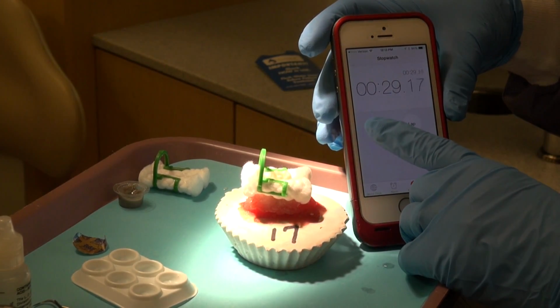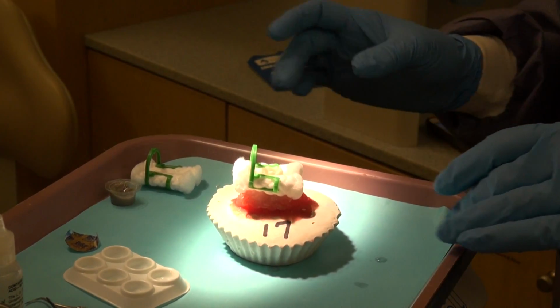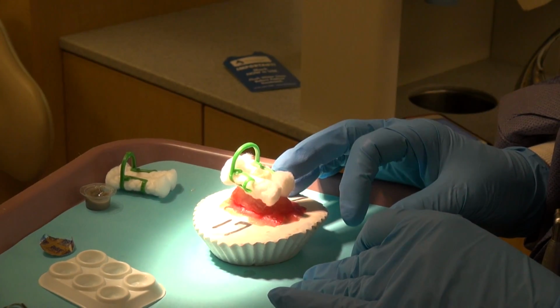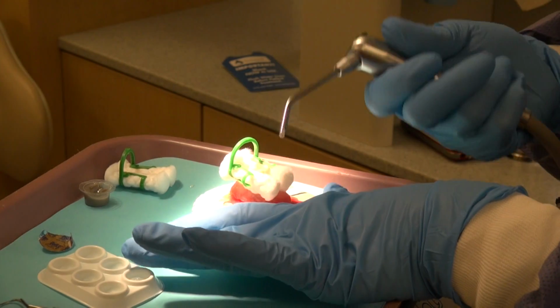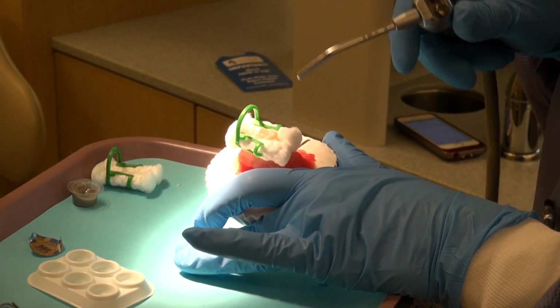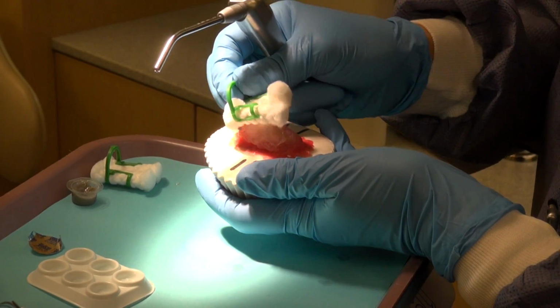And we'll rinse off the acid etch. Now, when you have this in the patient's mouth and you go to rinse off, you want to hold your HVE tip close to the acid etch, and as you rinse, suck up that acid. If this acid etchant gets on the gingiva, the tongue, the cheek, the lip, it will burn, so you want to be very careful with that.